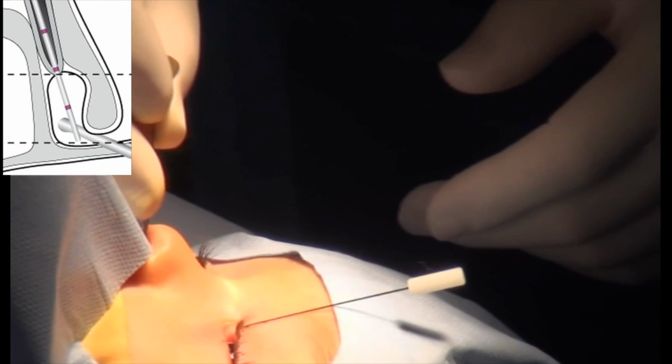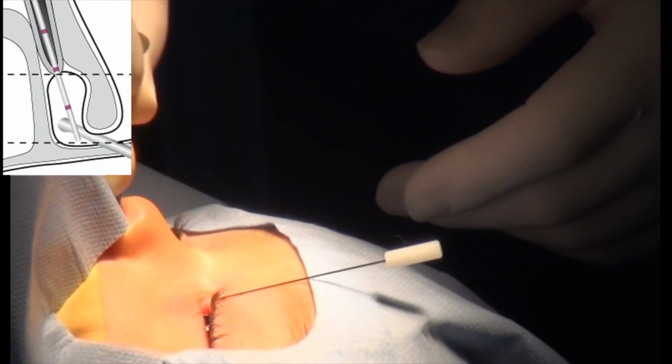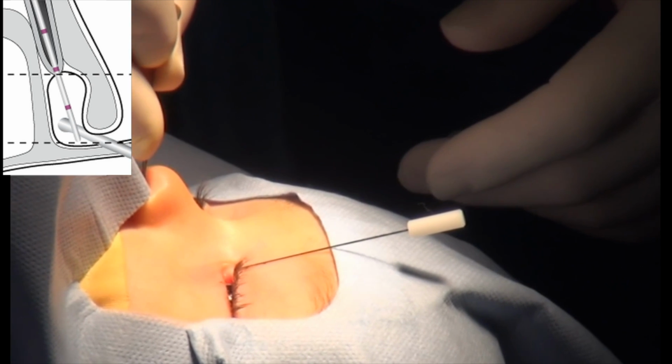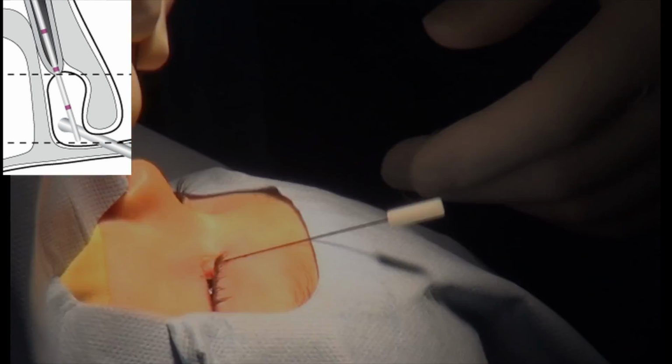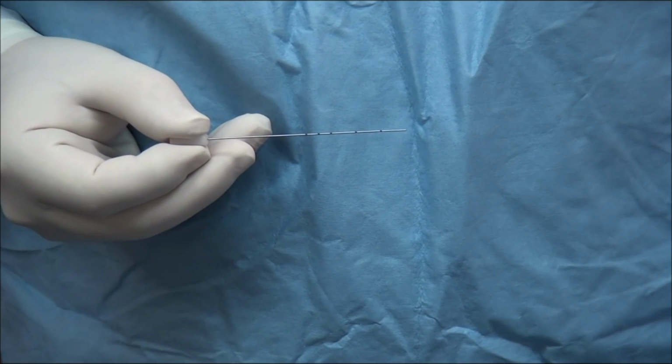The surgeon begins by probing first with a Bowman probe, then with the disposable sizer. Confirm that the stenosis is simple, located at the valve of Hasner, as complex stenosis is contraindicated. Confirm metal-to-metal contact in the nose, ensuring a false passage has not been created. Keep the disposable sizer in place and use it to measure for the appropriate length Masterka.